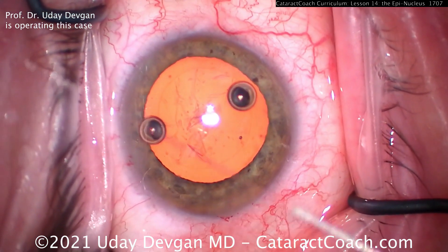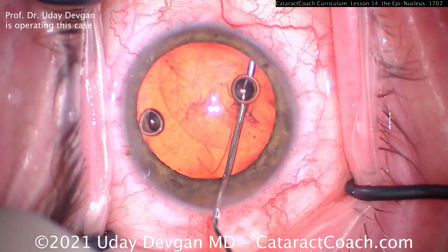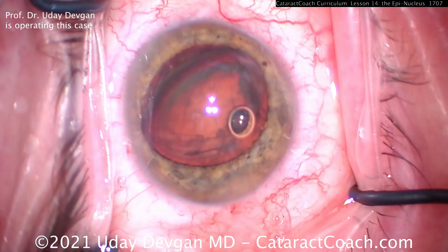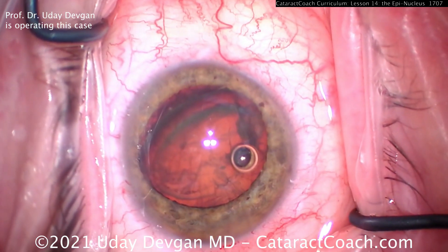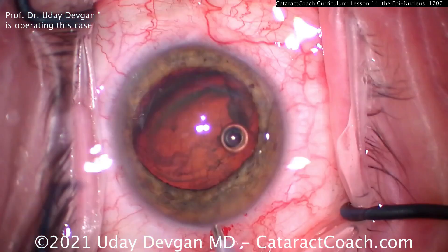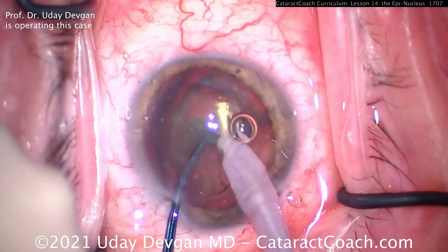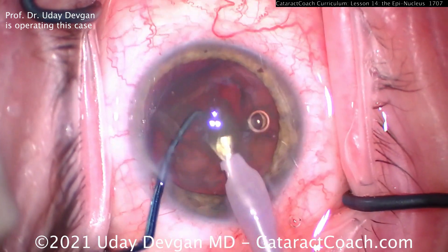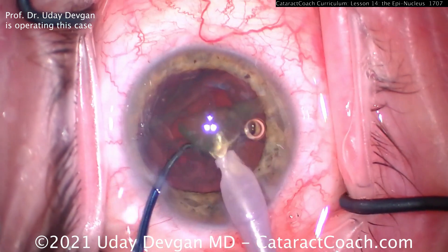Here comes the hydrodissection with a 27-gauge blunt cannula — nice and easy, there's a good wave — and the nucleus comes out of the bag. Now I delineate — do you see that extra delineation mark? A little more viscoelastic to protect the cornea. Going in with the phaco probe on high vacuum, high flow — buzz into that nucleus, put the chopper around it and chop it in half, and we're going to take out that endonucleus. But look what happens to that epinuclear shell: it falls back into the capsular bag.